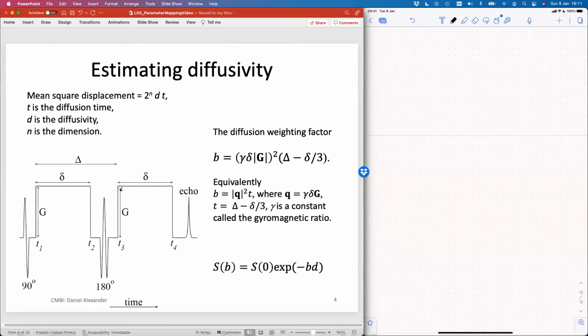during which the scanner introduces a gradient into its internal magnetic field. And there are essentially 5 degrees of freedom in this pulse sequence, or 5 device settings using the terminology of earlier lectures. One of them is the length little delta of these pulses. Another is their separation, big delta. And the last 3 degrees of freedom are the elements of this gradient vector G, which has both a magnitude and a direction describing the gradient in the magnetic field.